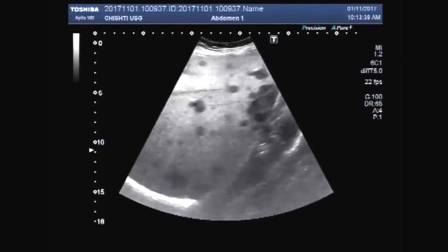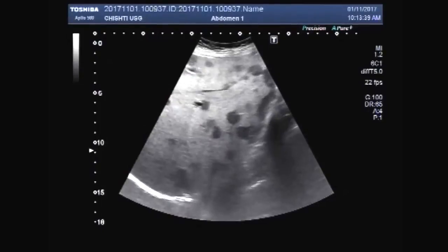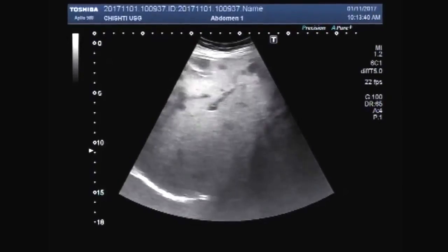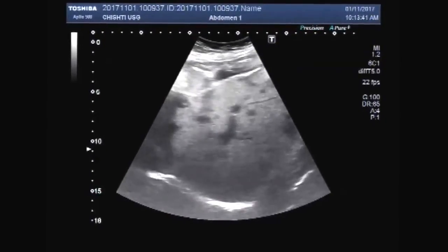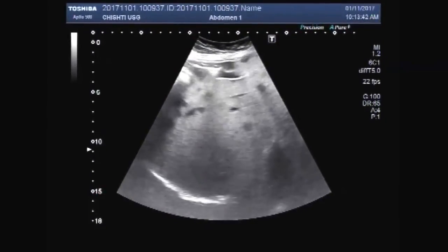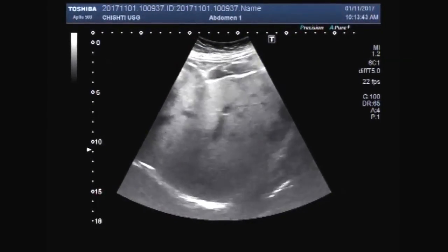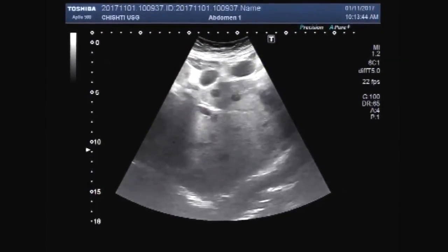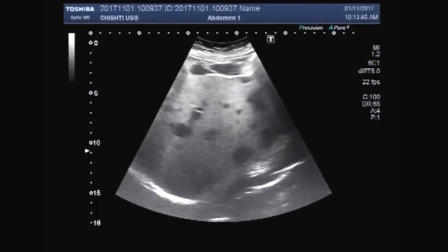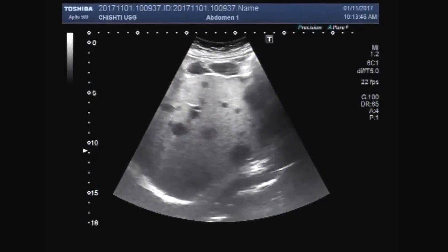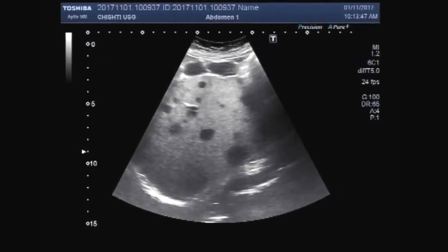You can see the right lobe and left lobe of the liver — both lobes have multiple masses.